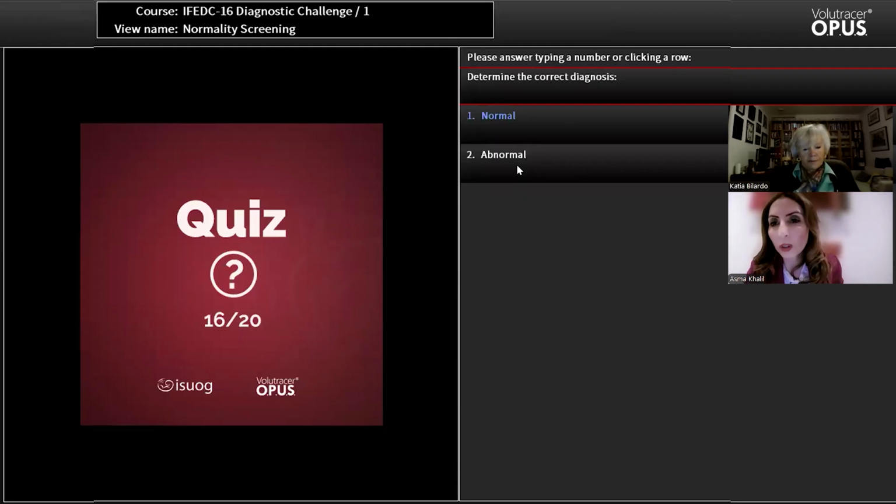So, normal, abnormal? More than 93% of you got it right, so it's abnormal. The question is, what is the abnormality? What is the differential diagnosis? And again, 45%, so nearly half of you, got the diagnosis correct.